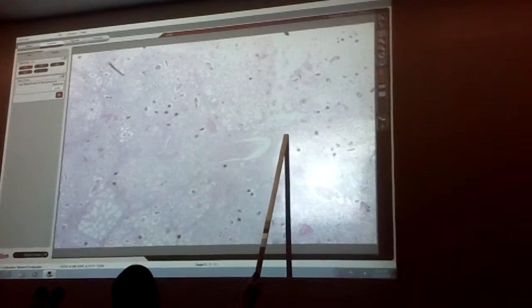In between, so this stuff here, running up this way, running around this way, and around, would be the interlobular connective tissue. So notice how there's not much that you see, because the lobules are now larger because the glandular alveoli have what in them? Milk.